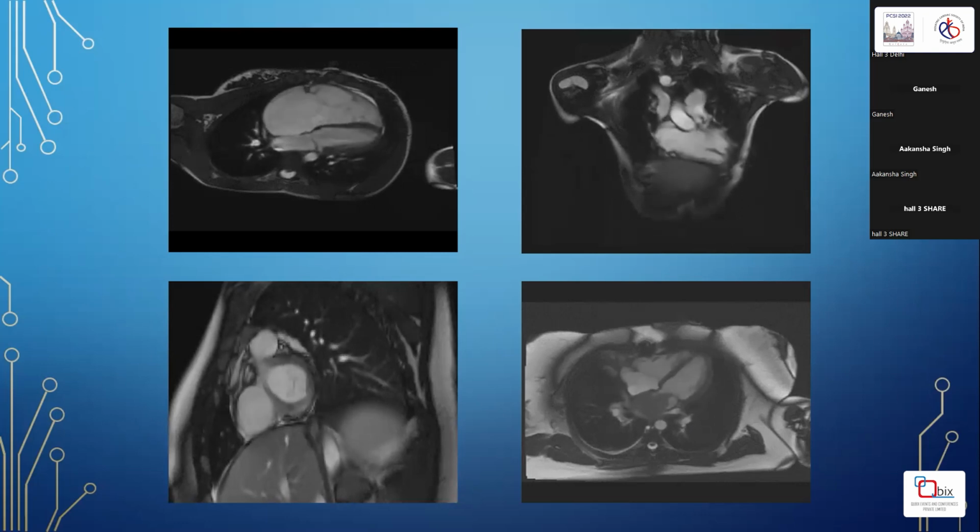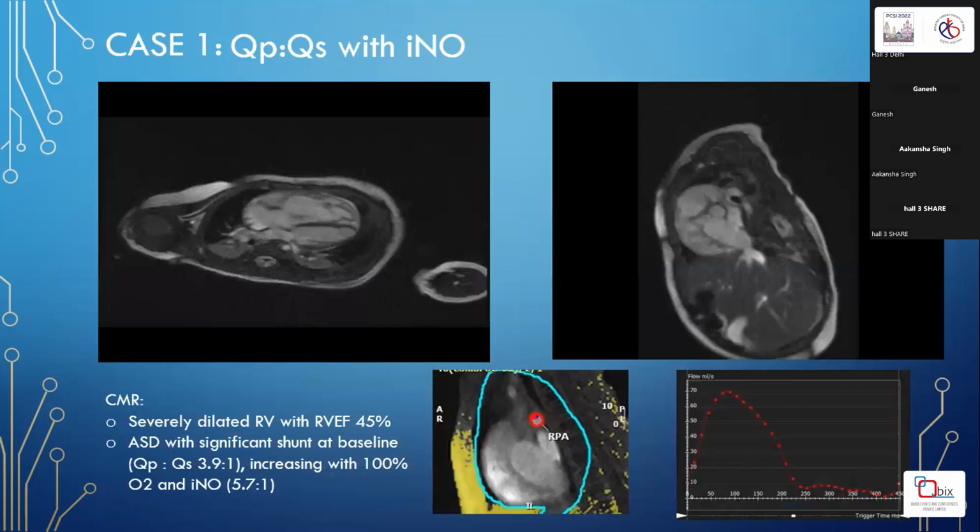in pediatric cardiology. The first case I'm going to talk about is an ex-preterm who had a neonatal diagnosis of a moderate fenestrated ostium secundum ASD with pulmonary hypertension secondary to lung disease of prematurity, was discharged home, but was readmitted at 5 months of age with a polyviral respiratory infection with decompensation and RV failure.